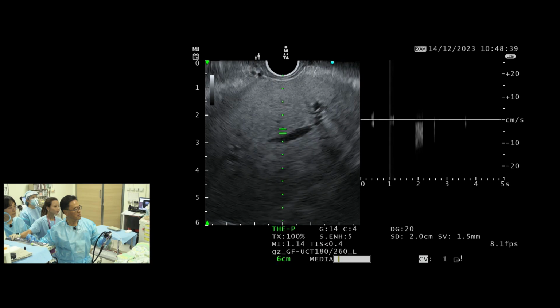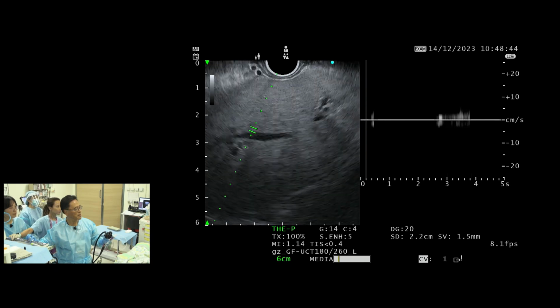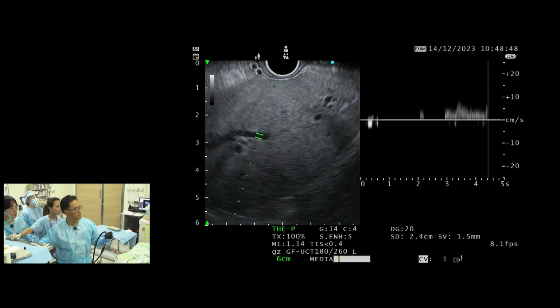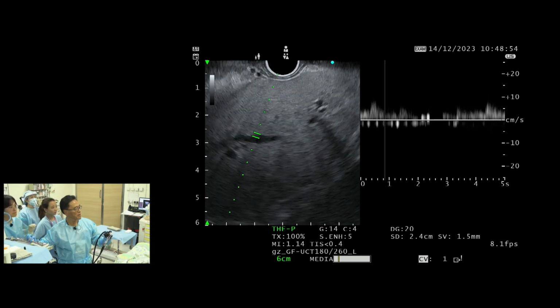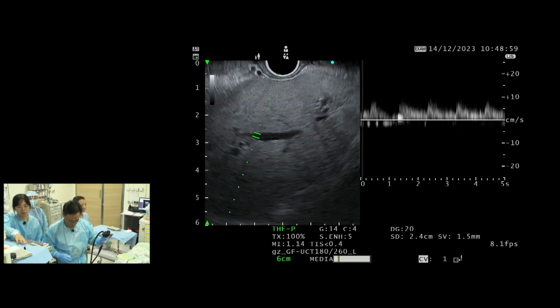That's okay. Typically, I would confirm that, but let's see. I'm not getting a good signal. Yeah, I think it's better. Yeah, there it is. Now we can see the pulse wave. Yeah, right there. Okay. That's good. That's fine.